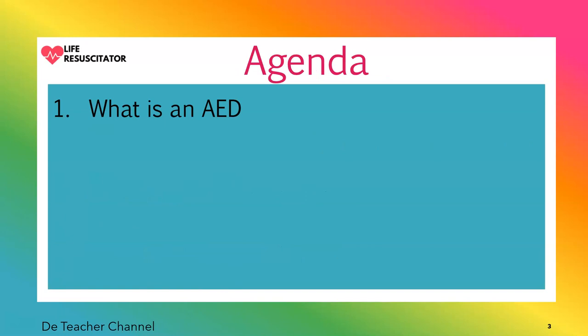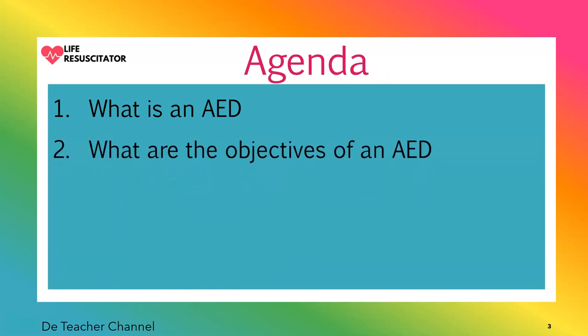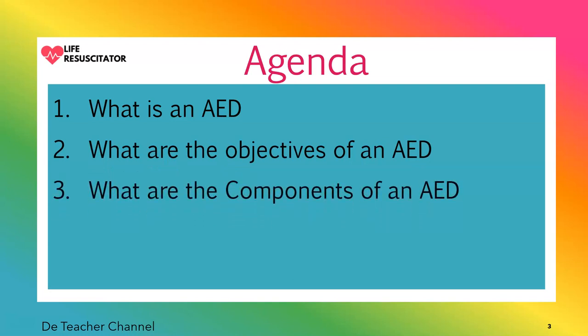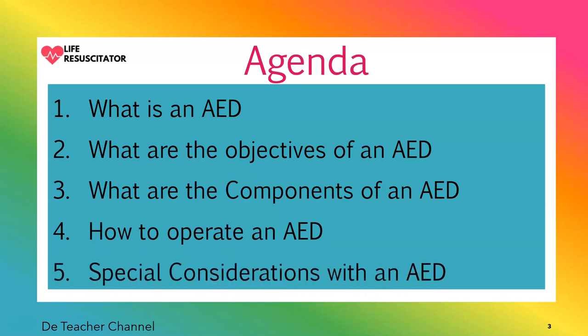Agenda number one, what is an AED? Agenda number two, what are the objectives of an AED? Agenda number three, what are the components of an AED? Agenda number four, how to operate an AED. Agenda number five, special considerations with an AED.